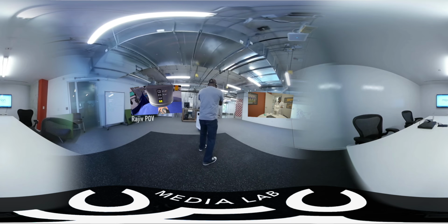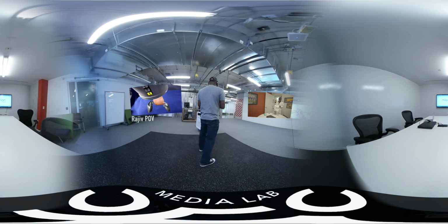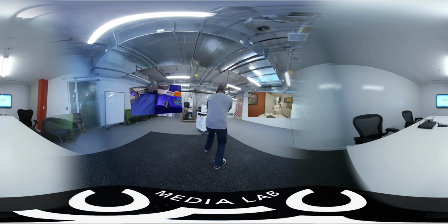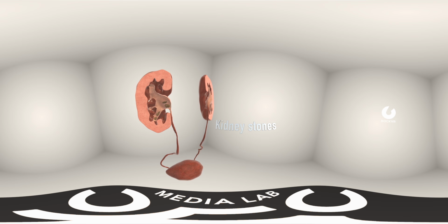This operation, which we use typically for bigger kidney stones, involves creating a track where we'll put a little needle and a wire, basically creating an access point through which we can put a scope and get into the kidney on top of a kidney stone and then break it with various tools that we would have.